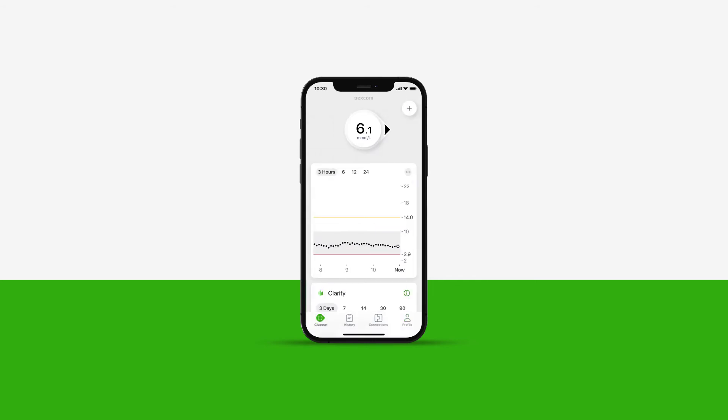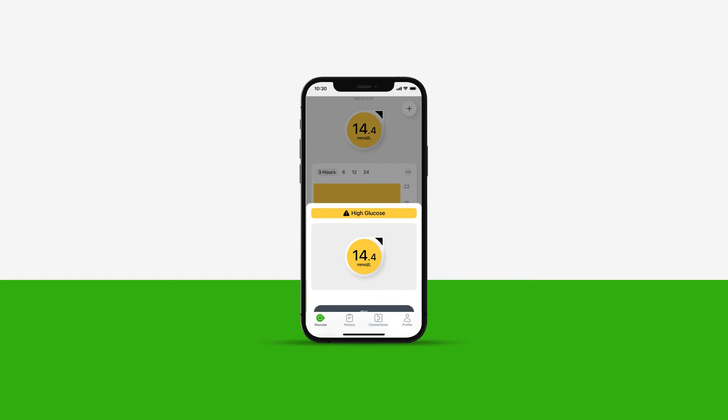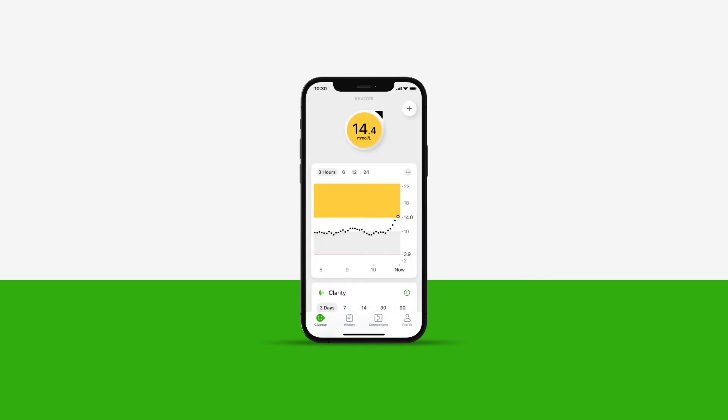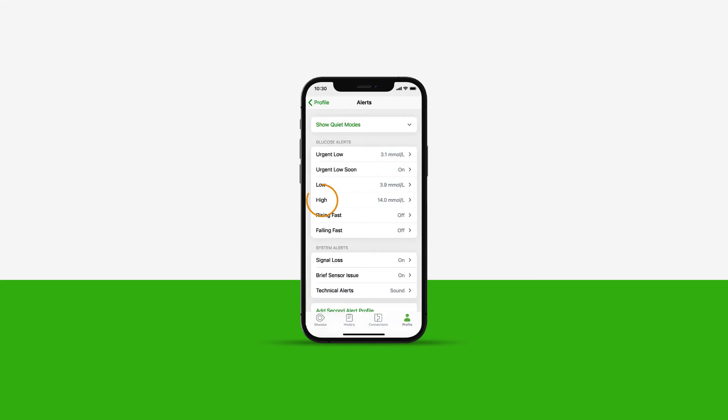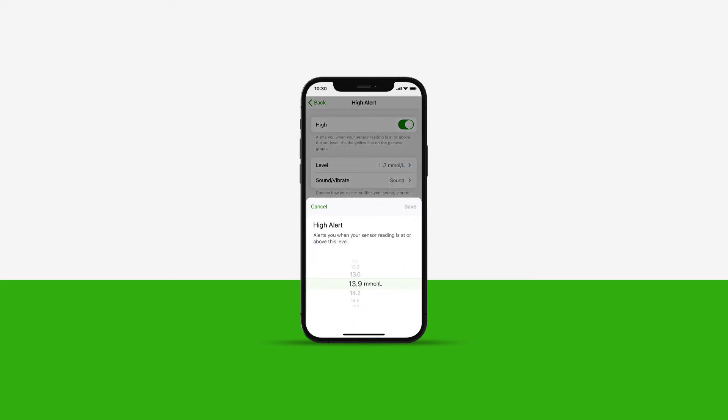Your high alert is the yellow line on the glucose graph. When you are at or above your high alert setting, the app alerts you and the circle turns yellow. Now let's customize the high alert. Tap High and choose the level you want to be alerted at. Once done, tap Save.